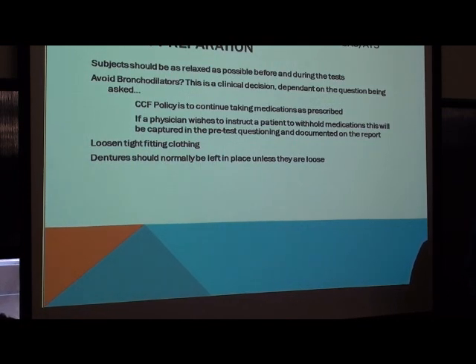So in that setting, you would also instruct the patient to stay off the medicines. I can pretty well assure you it's safe to do so and test without. But that's, as Kevin said, a call made in the office prior to testing rather than a laboratory policy. But it's a pretty common one. Thank you. That's an excellent point.